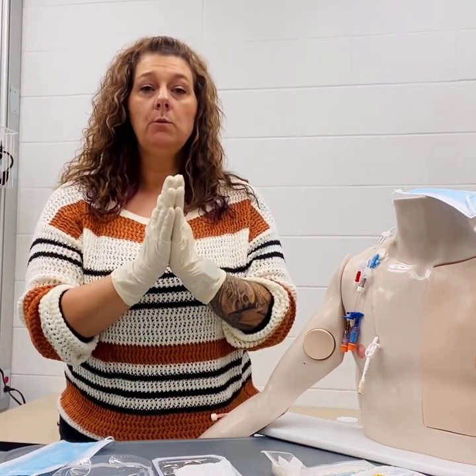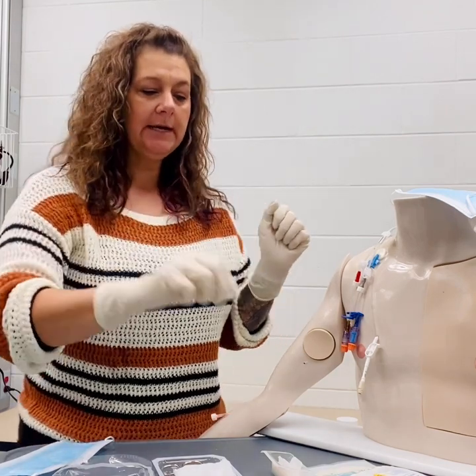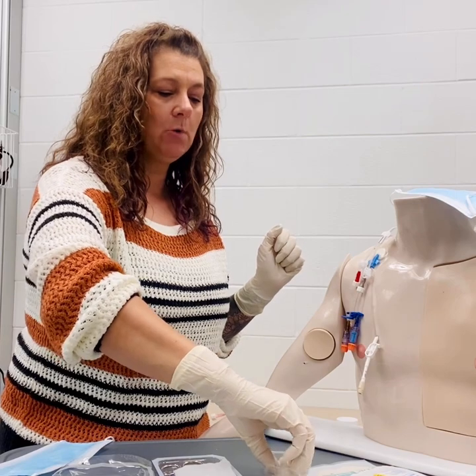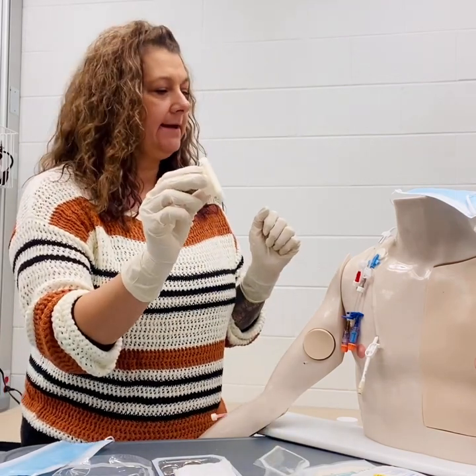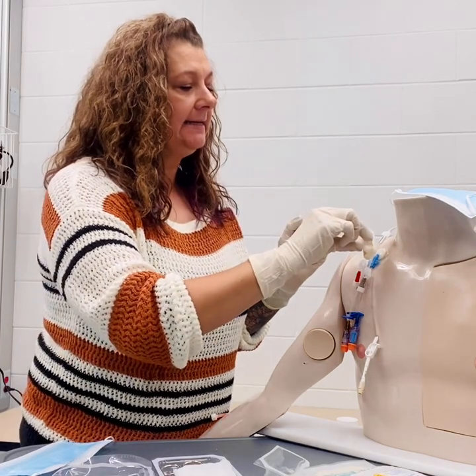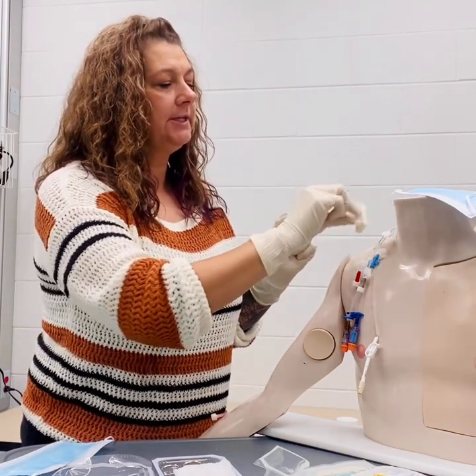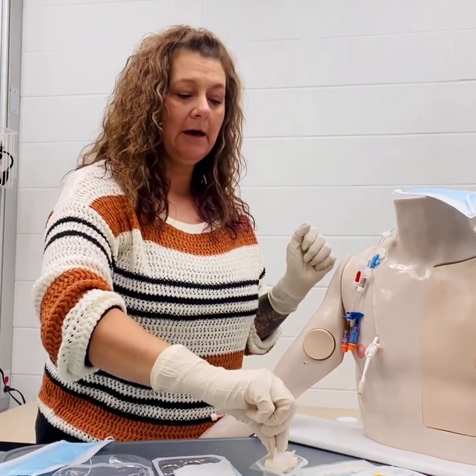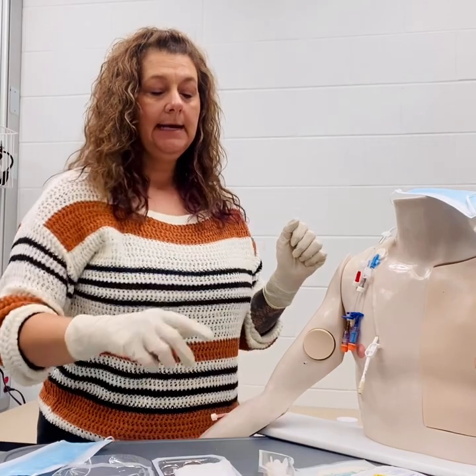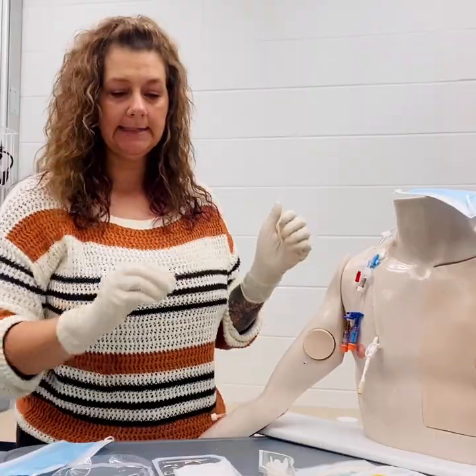Once we have our sterile gloves on, we can go ahead and begin the rest of the procedure. Firstly, we want to take our chlorhexidine wipe or chloroprep, pop that, and clean from the insertion site in a circular motion for around 30 seconds and allow that area to dry. Again, we have our mask on and the patient has their mask on with their head turned away as we're doing this.